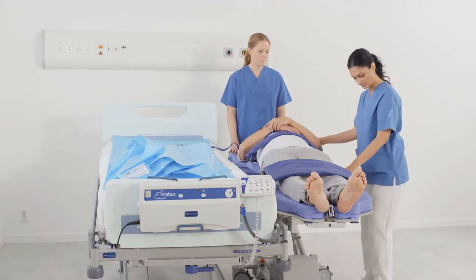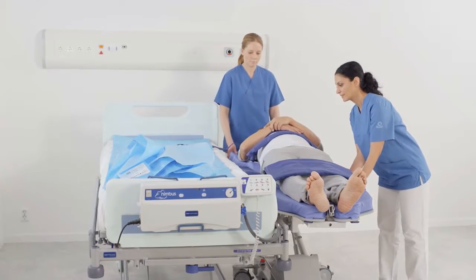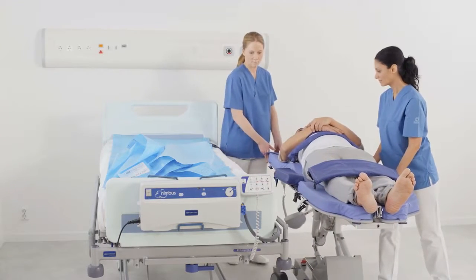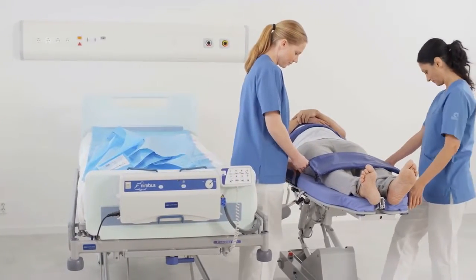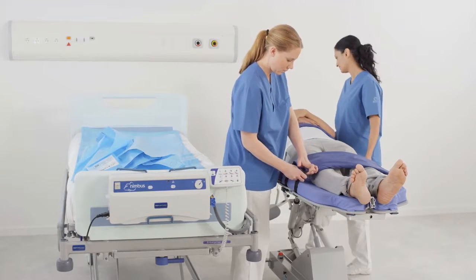Tap the brakes to release them. Move the Sara Combilizer away from the bed so that a caregiver can access the side facing the bed. Tap the brakes to lock them. Fasten the safety straps.